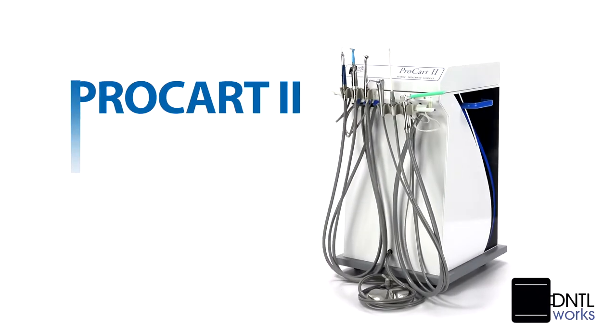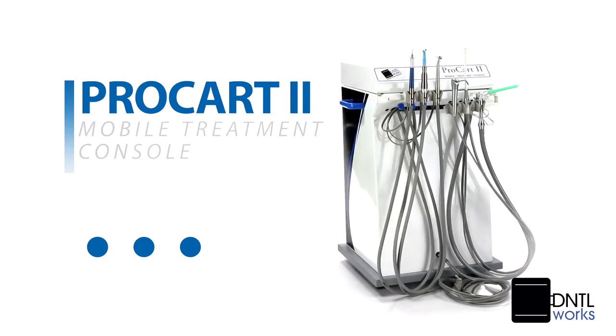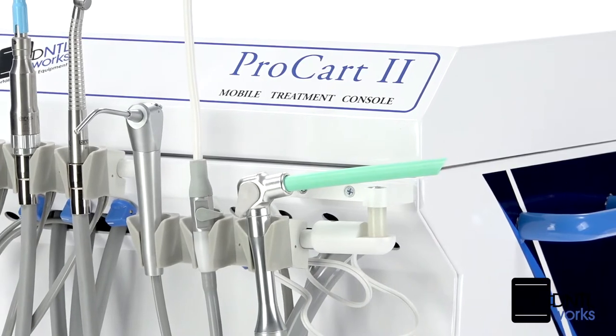The innovative DentalWorks ProCart 2 incorporates the best attributes of self-contained mobility in a high-tech design that's perfectly suited for professional in-office use.